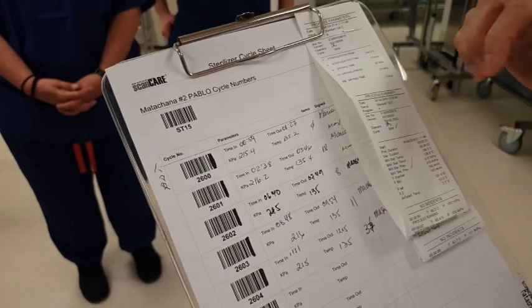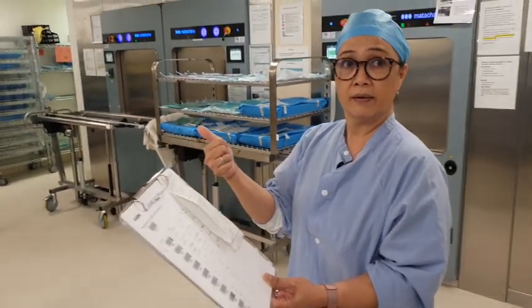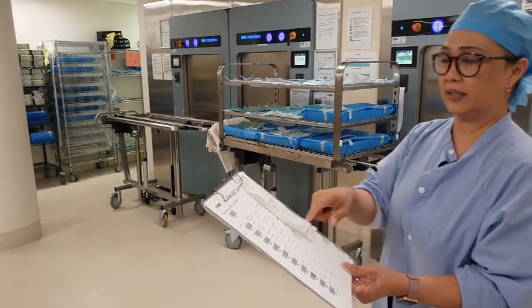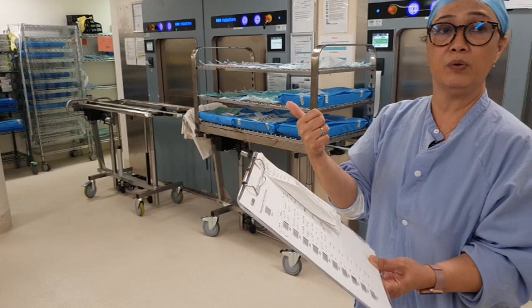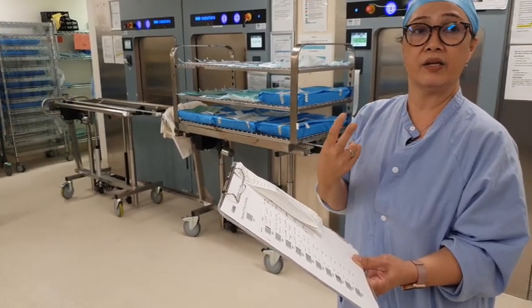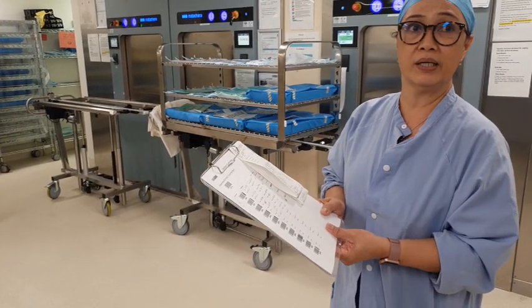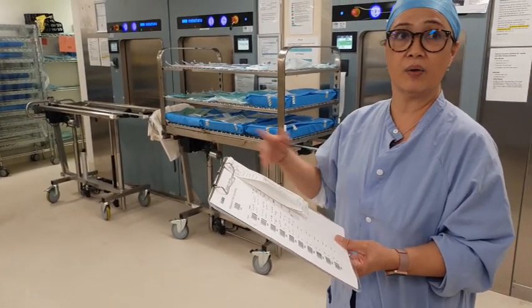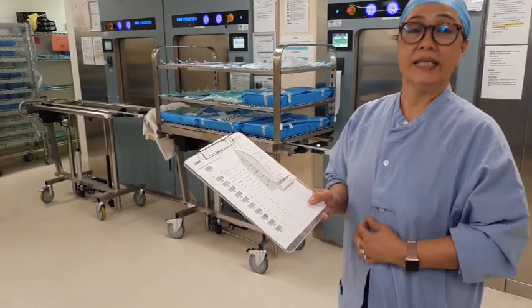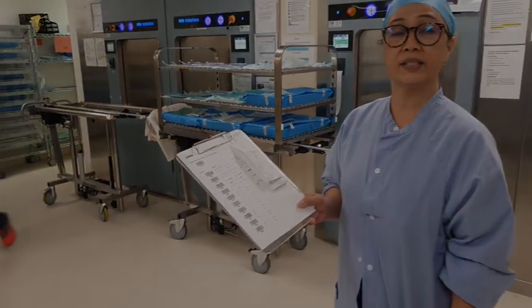We have 134. So that's a readout of the sterilizer. There is 134, and then there's a 10 minute holding time, and then another 4 minutes to be sure that it's really ready, and that's the standard that we have to go through. So multiple layers of safety there, isn't there? We've got multiple indicators and multiple things that we're tracking. Correct.